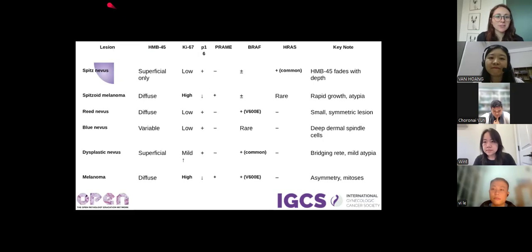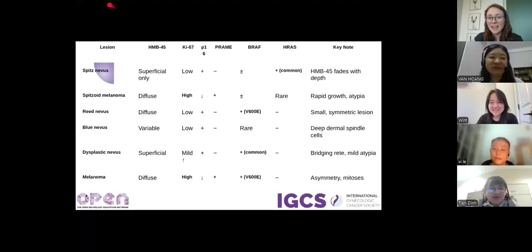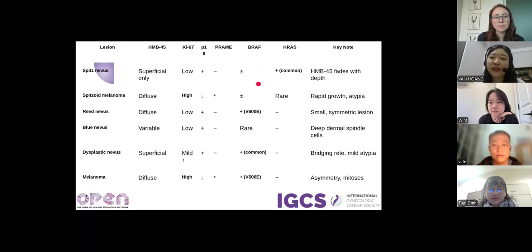Awesome. Do we have any other questions for Van? I have a question. I saw that you have BRAF and HRAS mutation. Do we usually use this stain in diagnosis, like in reality? I think in the US it's quite common, but it's not in Vietnam. In Vietnam, we don't have the conditions to do this.